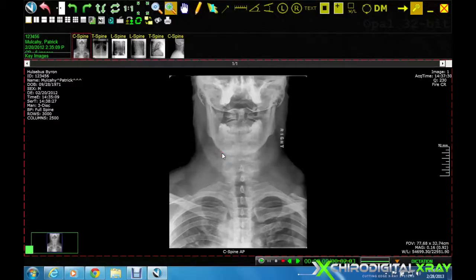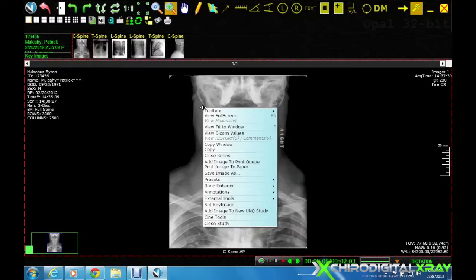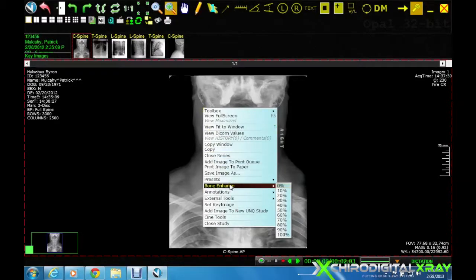The bone enhance feature can be accessed by right-clicking on the image and selecting bone enhance from the drop-down menu. This allows us to sharpen the visibility of the bony cortex and trabeculation.